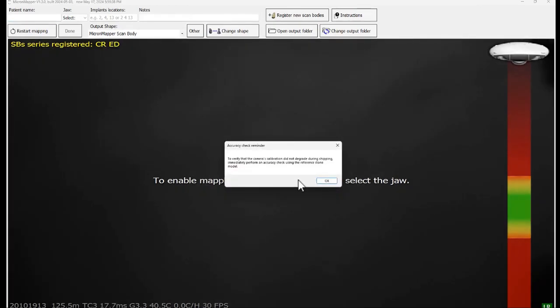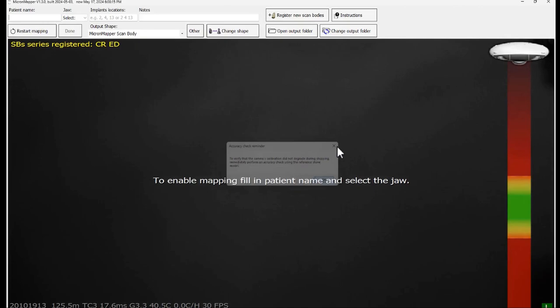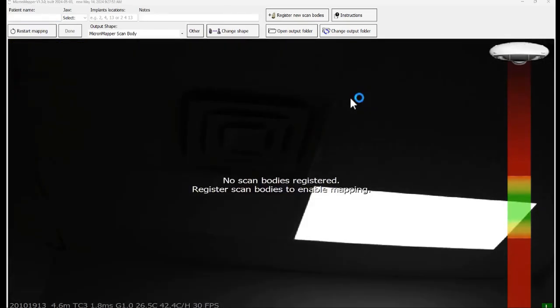The system will then throw another pop-up window as a reminder to verify the camera's calibration. Click OK. On the screen, you see no scan bodies registered.